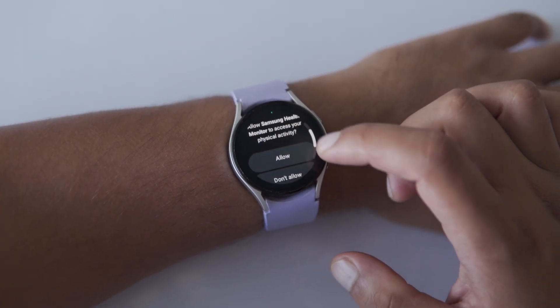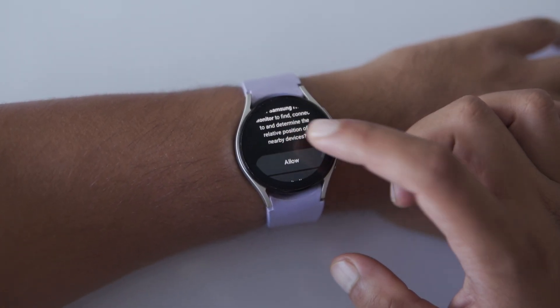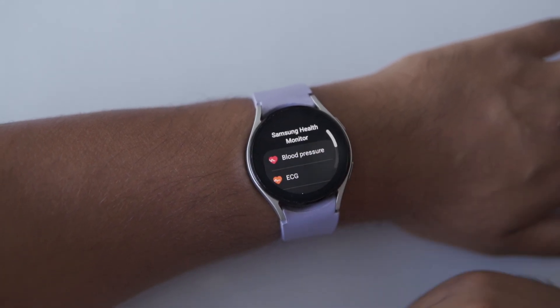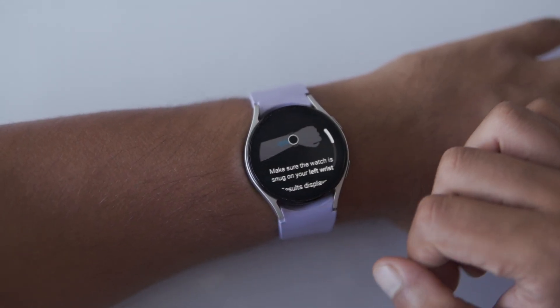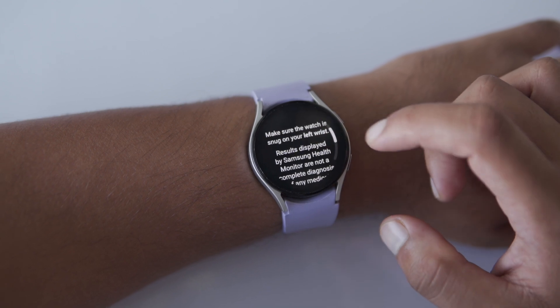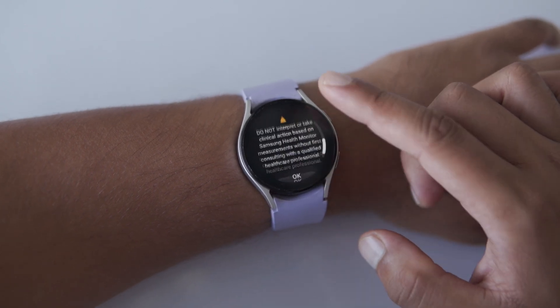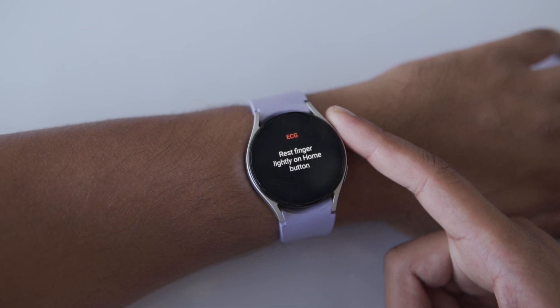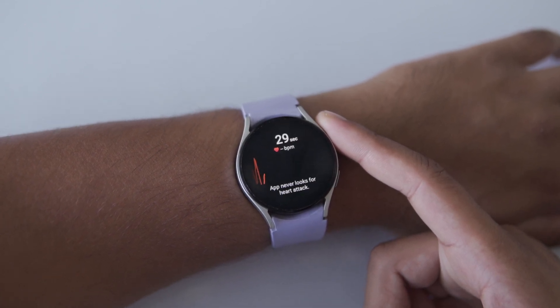Once you're in the app, you'll see an option that says ECG — just tap on it. Before you start recording, you'll need to review some information and allow a few permissions that pop up. Now here's where it gets really interesting: with your opposite hand, lightly rest one of your fingers on the watch home button for 30 seconds.